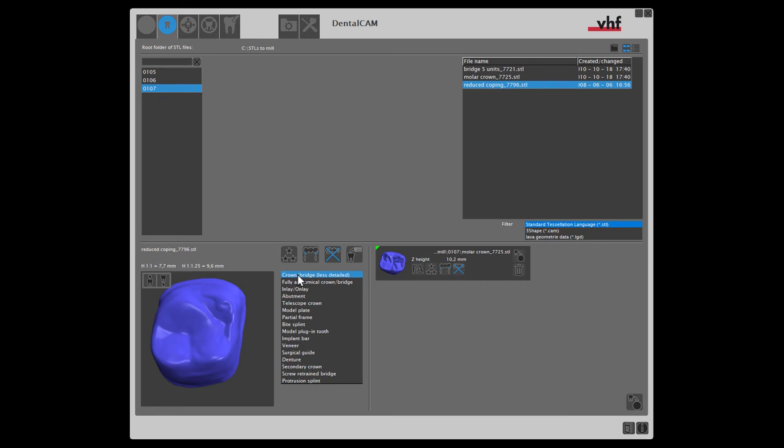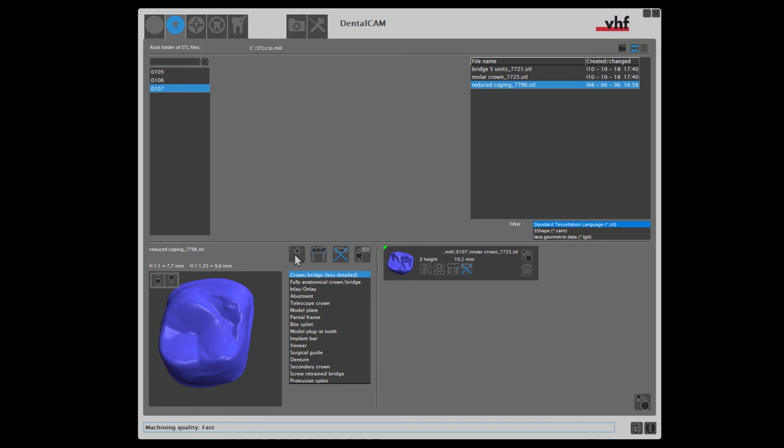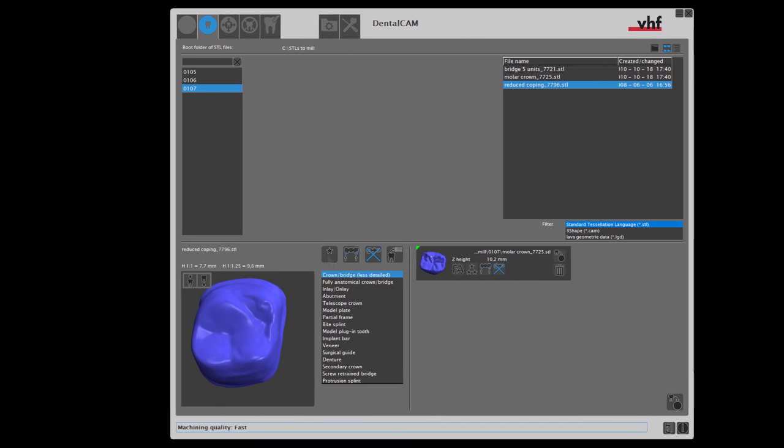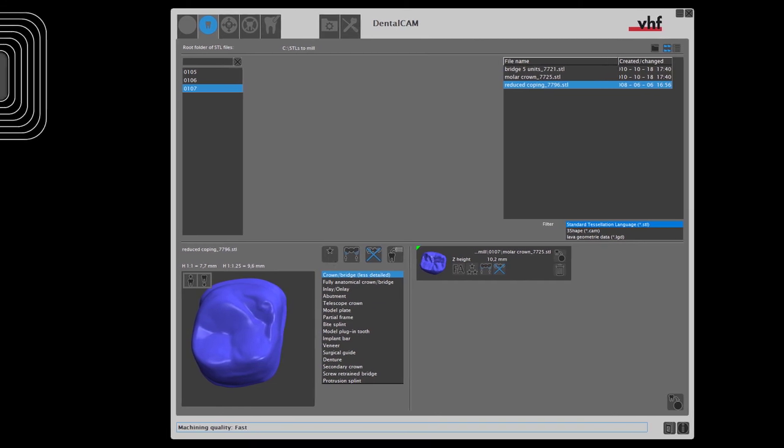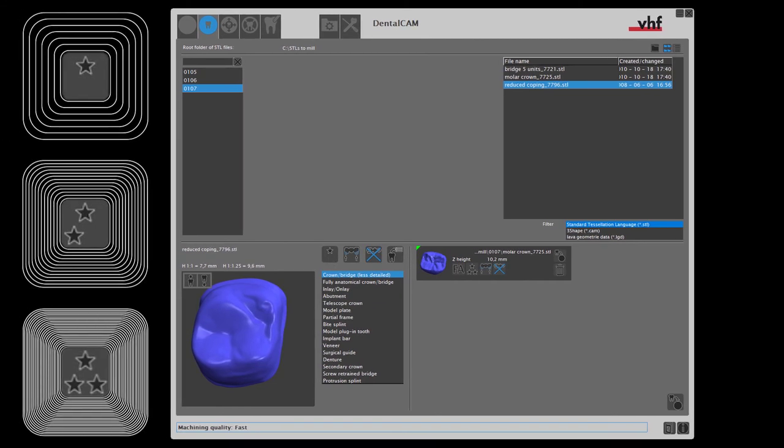In addition, this object does not require very smooth outer surfaces, so we can select the quality for this object. This will save time and reduce tool wear.